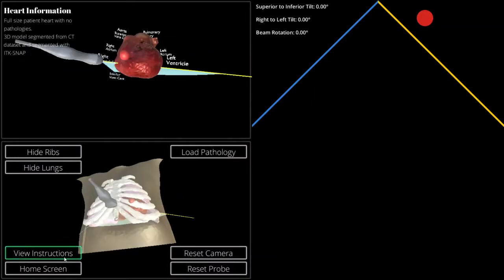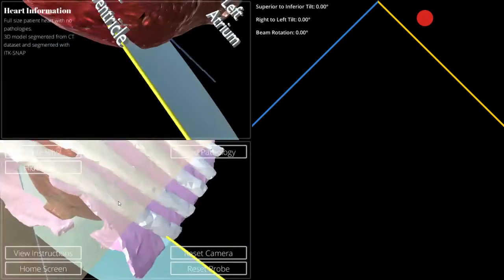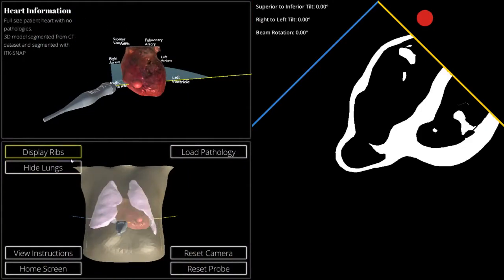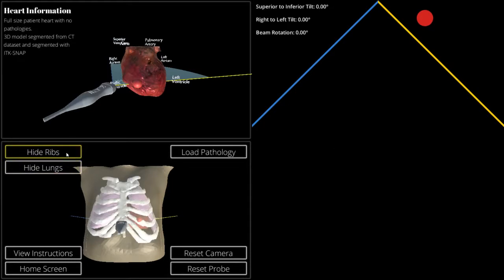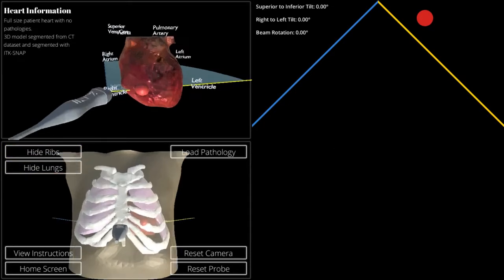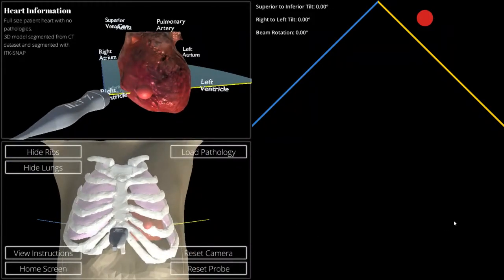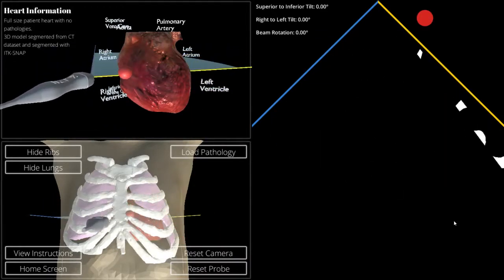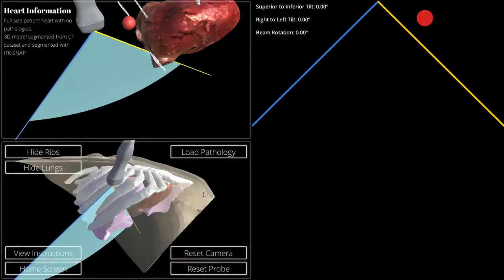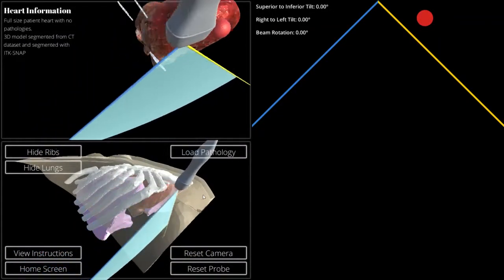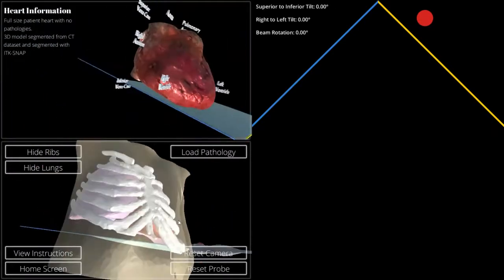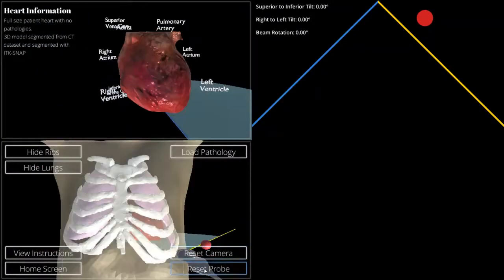At any time, you can back out to the instruction screen or home screen. If you ever lose your way, like if you're zoomed in too far, you can reset the camera. We can also turn the ribs on and off. But for the time being, we're going to keep it on to keep the simulation as realistic as possible. The probe moves as you would expect in 3D space, and if we rotate the chest, you'll see that the probe follows the contours of the body quite smoothly and will not fall off.